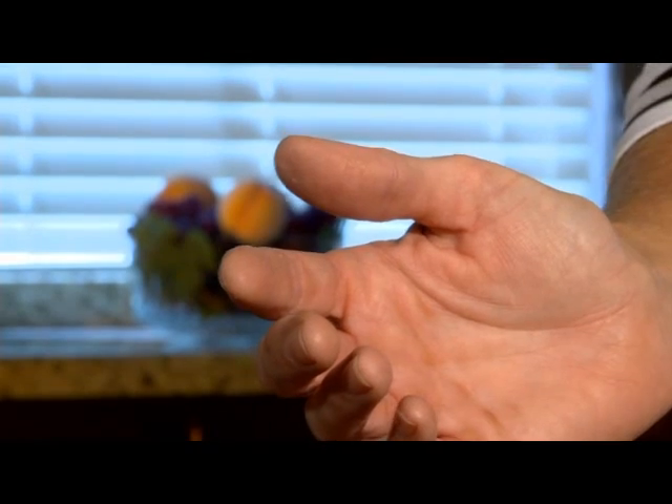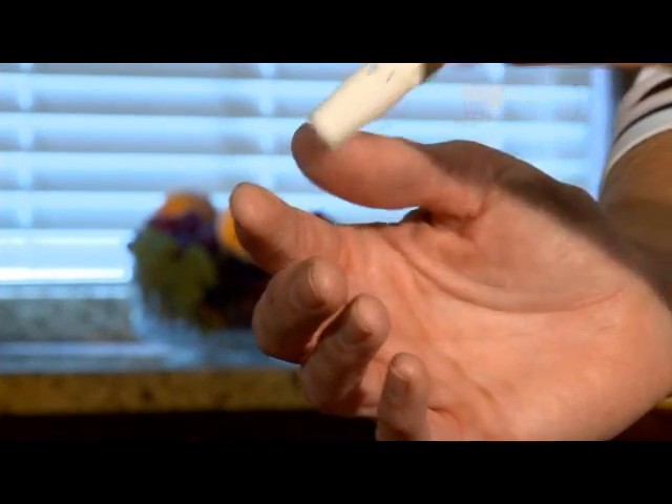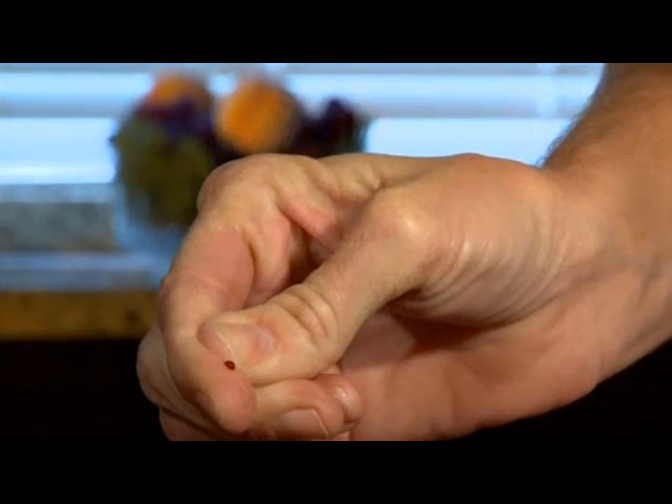Hold the lancing device firmly on the site to be tested and press the blue button on the lancing device to fire it. You should feel a slight prick, and then a drop of blood will form on your finger.